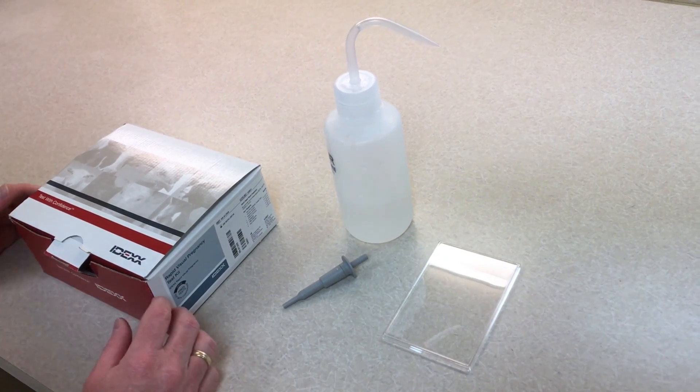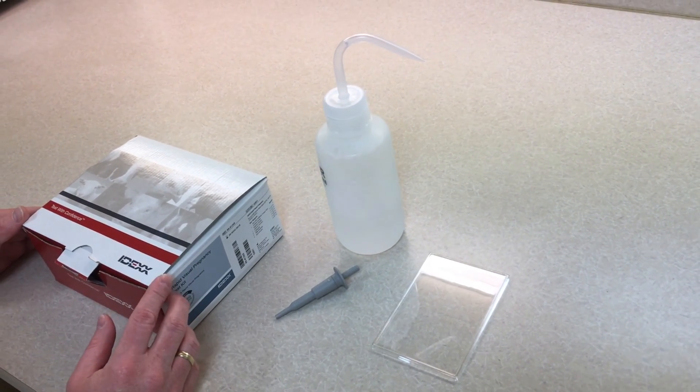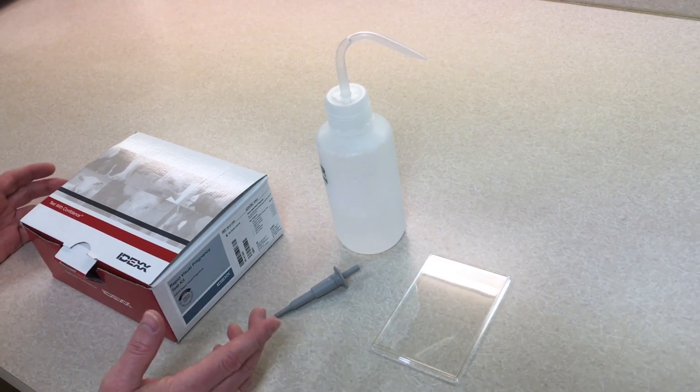Here's a quick video on the new IDEXX Rapid Pregnancy Test Kit that you can actually do at home.